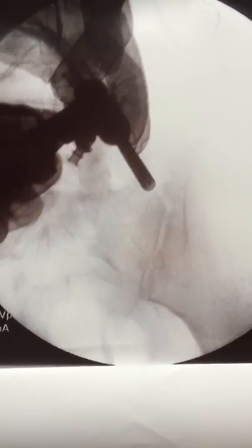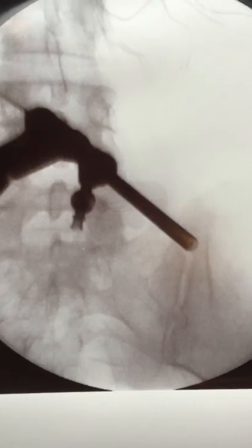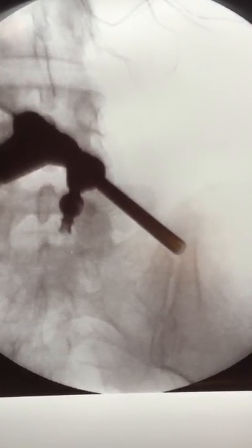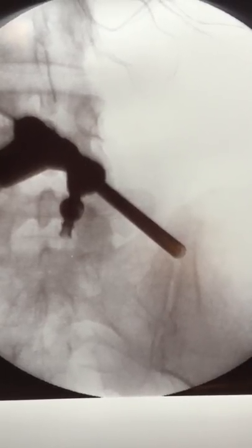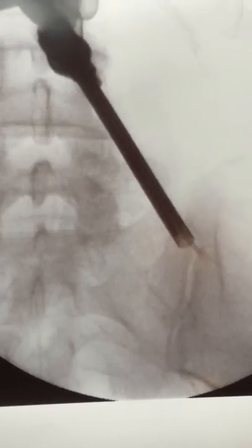Here you see the endoscope in the superior aspect of the sacroiliac joint as we're entering the joint to begin the ablation. Now I'm proceeding to move the endoscope down the joint to ablate both the nerves entering the joint and the joint itself.